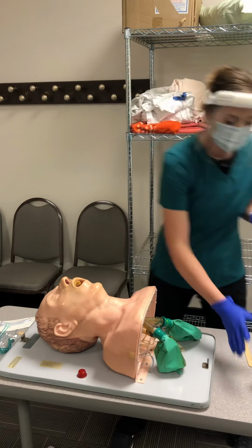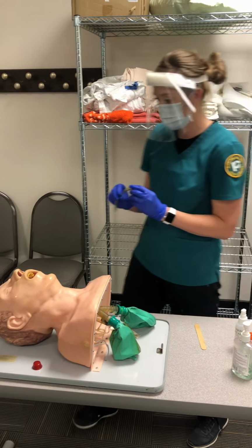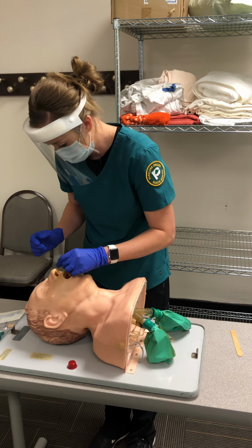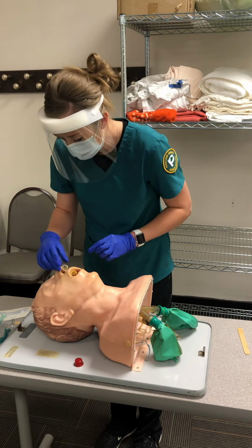When inserting this, I will lubricate the tube. That will glide in more easily. Then I want to insert this slowly into the naris. If I run into any resistance, I can twist slightly, which will help it go in smoothly.